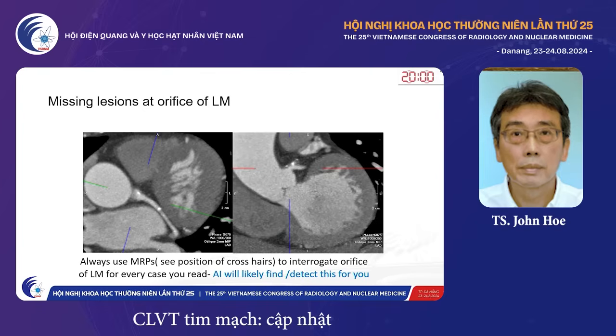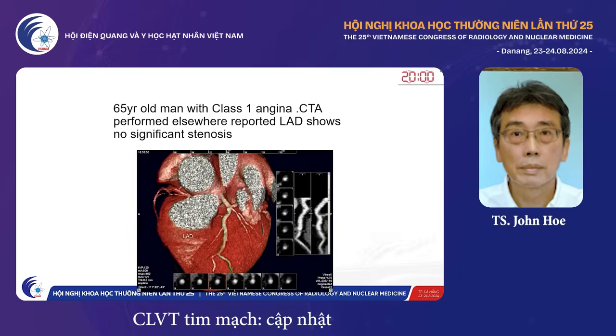So this is something you do not want to miss. The question is, will AI help you when it's available? It will probably find it for you. But until you get this AI software, make sure you do this every day for every case.